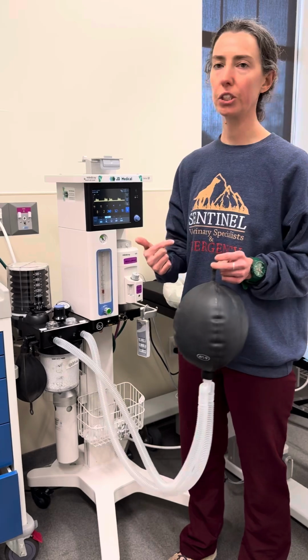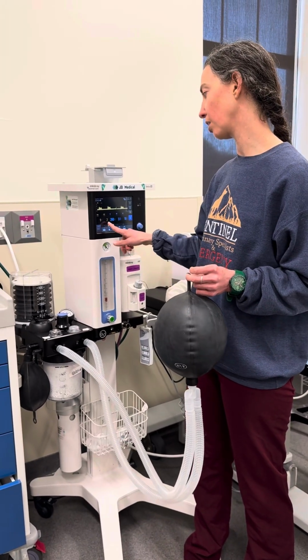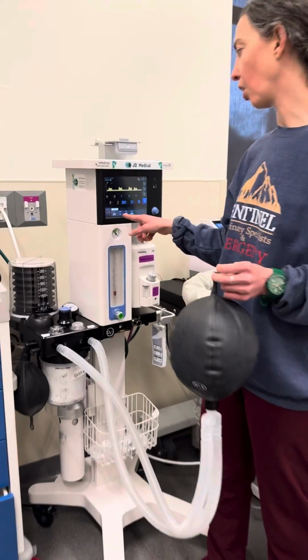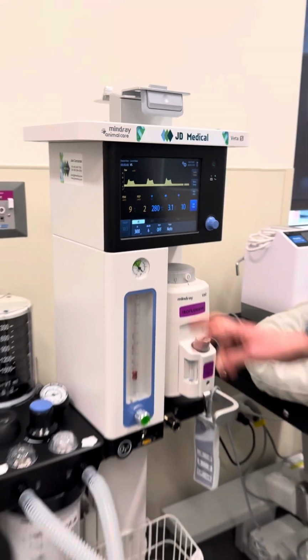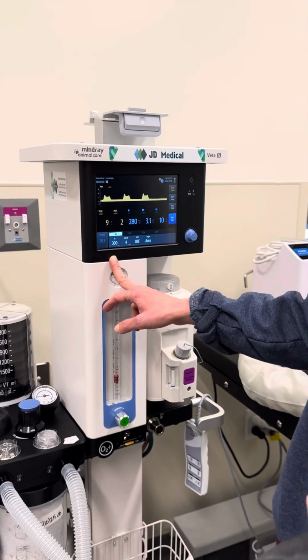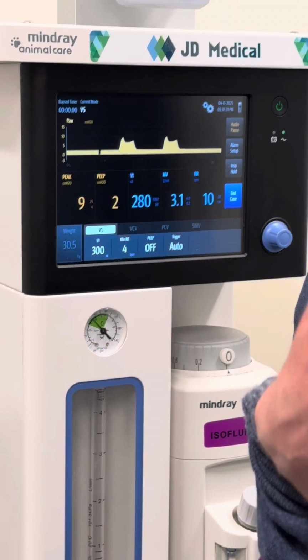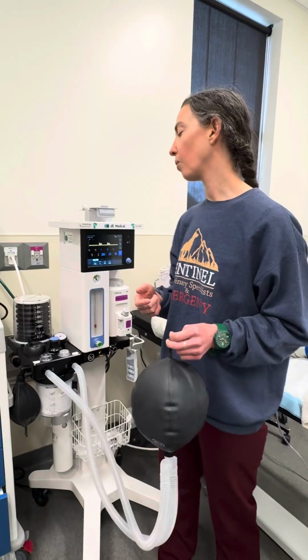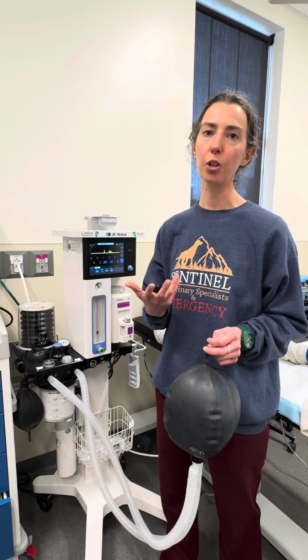So when you bring a patient in the OR and you go ahead and put them on the ventilator, it's going to automatically be on the VS function, which is volume support. And in that function, basically what we're asking the ventilator to do is to support each patient's breath. So if they take a breath, the machine's going to help give them a normal tidal volume breath.